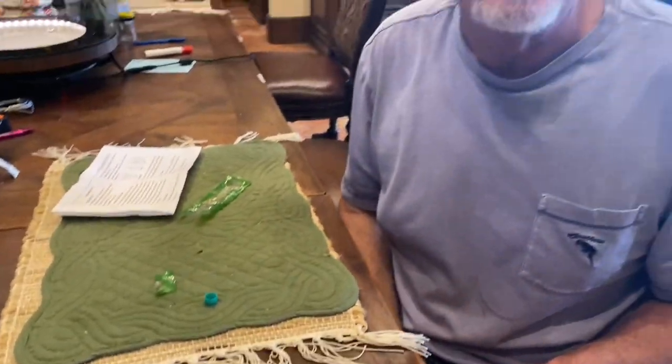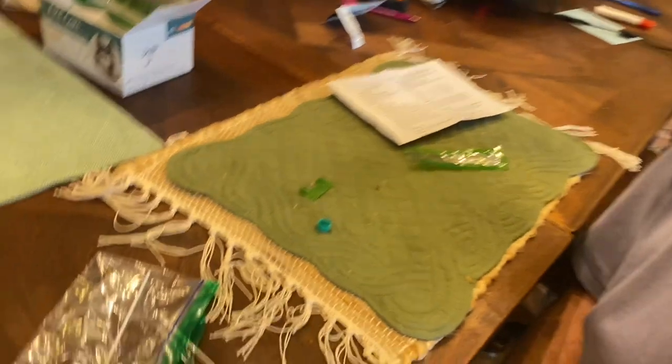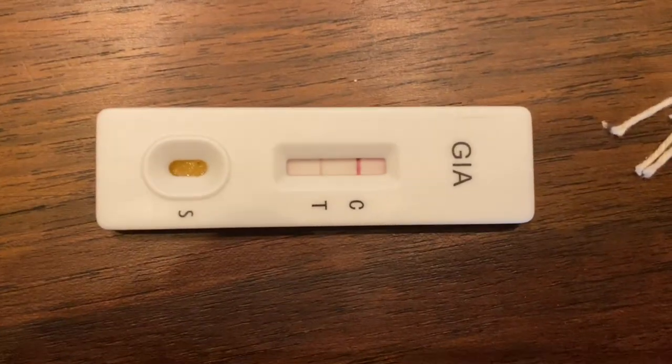So what do you treat Giardia with? Metronidazole. It's a tablet — it's an antibiotic. I actually buy a product called Fish-Zole because I can buy that without a prescription. I don't know the exact dosage off the top of my head — I have to look it up — and I don't give out dosages anyway. But there it is: that's a positive result.